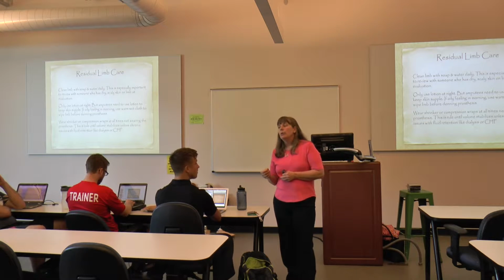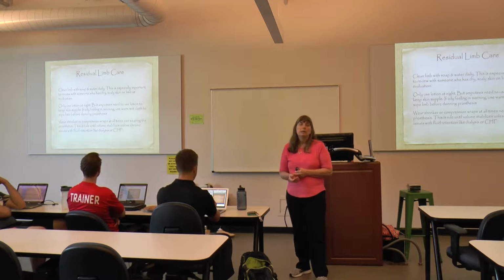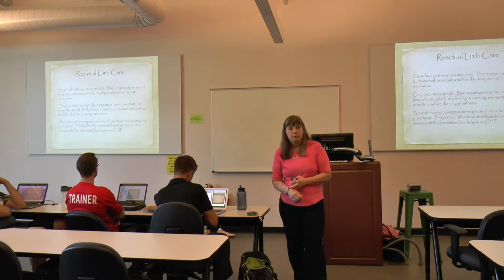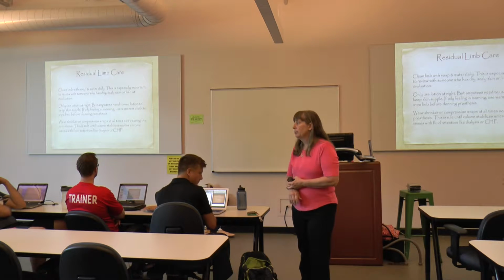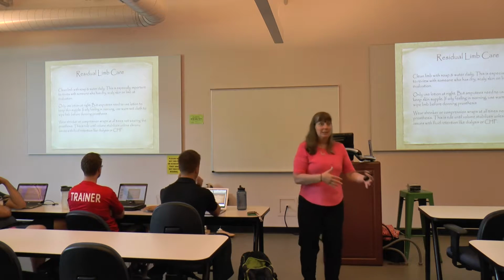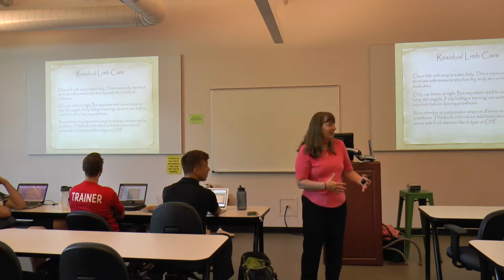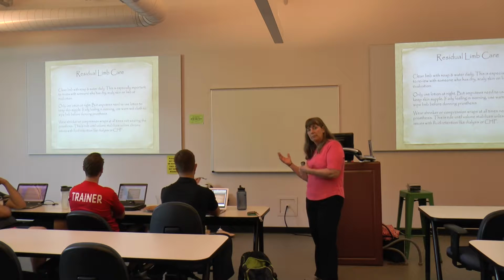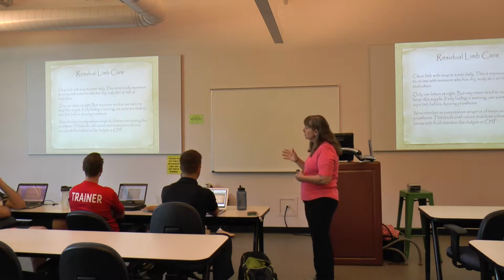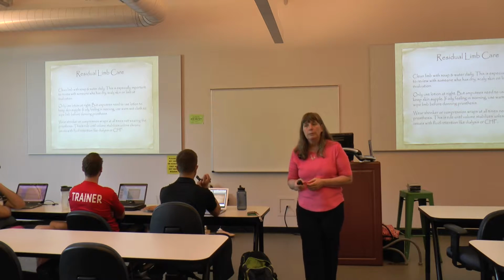Okay? If you have fluctuating edema, like dialysis, congestive heart failure, it is permanent that you should be wearing the compression garment, whether it's wraps or a shrinker, at all times you're not wearing the prosthesis. Make sure they know it's one or the other. People put the shrinker on, put the prosthesis on top of it. It doesn't work well, guys. You can tell them that, but if you don't tell them, they still are going to do those things. So make sure they understand that they still should be wearing that shrinker sock or that compression wrap at all times they're not wearing the prosthesis.